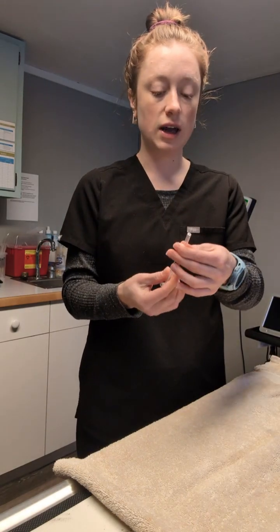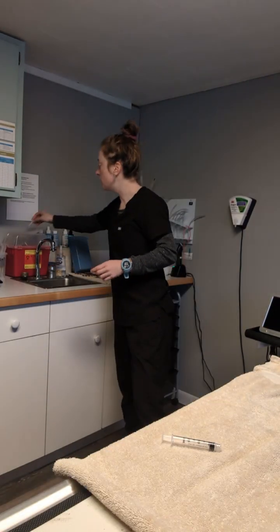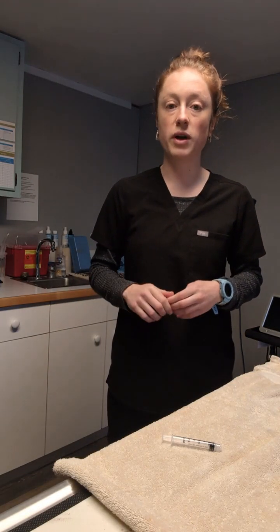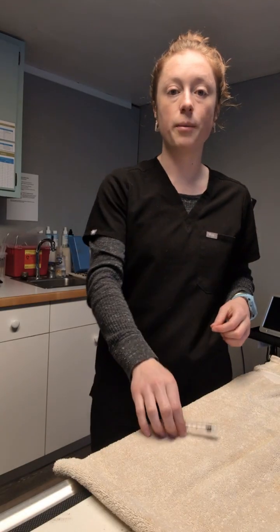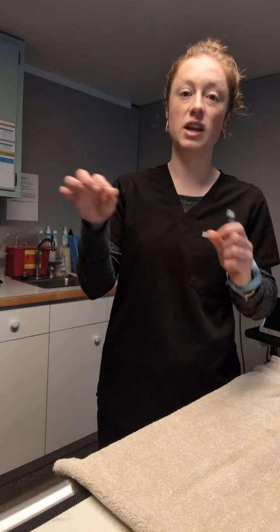So once it's seated, I can go ahead and twist it off, and I'll just put it directly into the sharps container. The sharps container is for any needles that are used, as well as any blades for surgery, any suture needles as well. And then we just want to make sure we're not exposing ourselves to the needle or pushing our hand up against it.